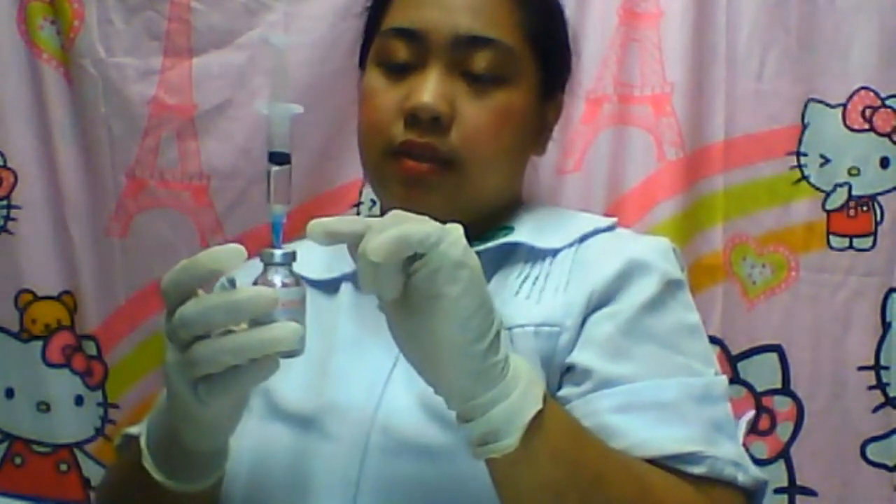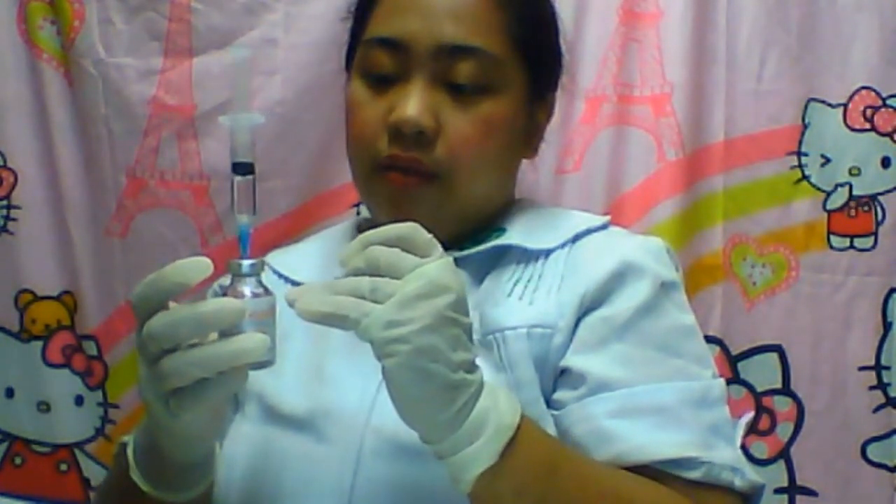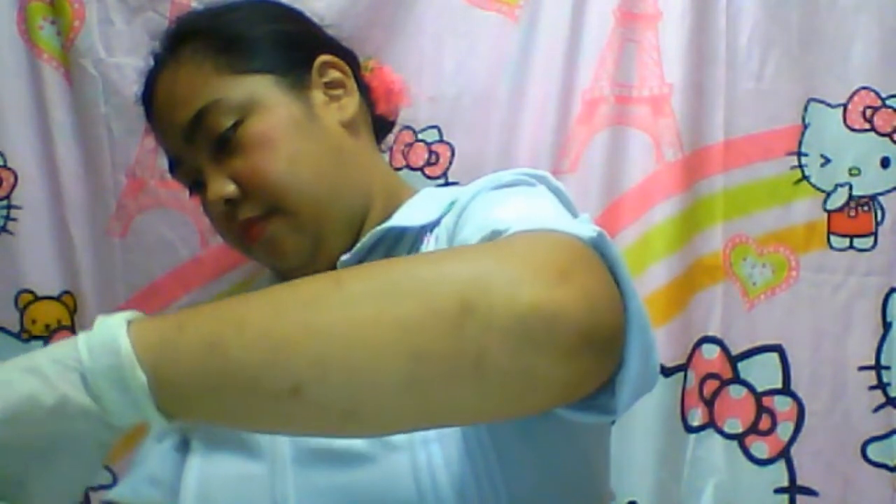Also, the needle that we use in aspirating the medication from the vial is actually a different needle than the one we will be using for injecting the patient. There you go — we will be replacing the needle.